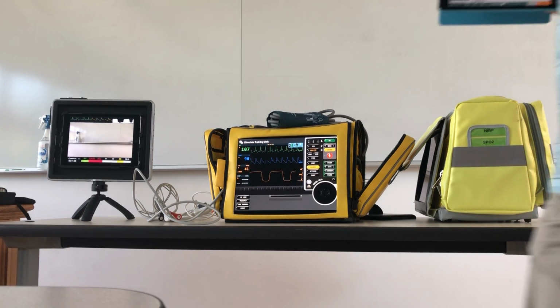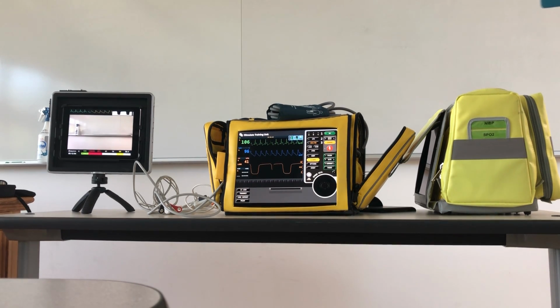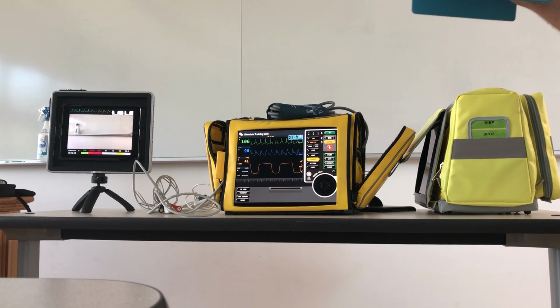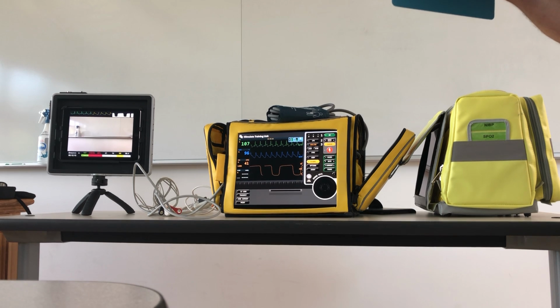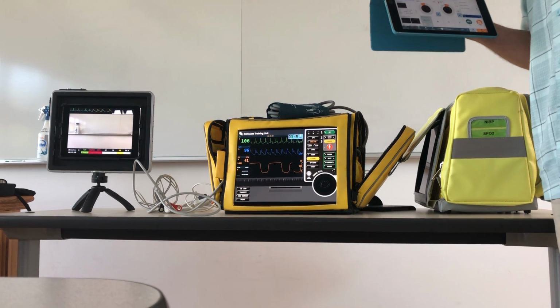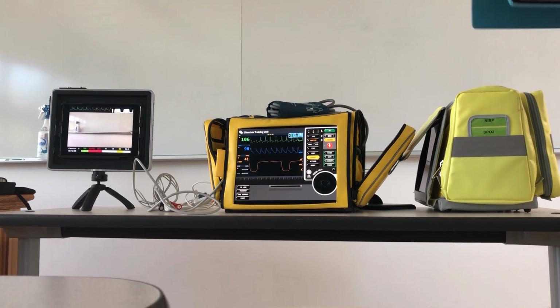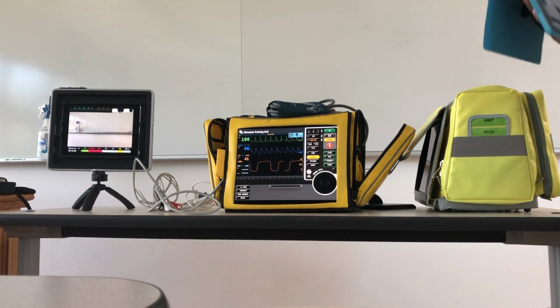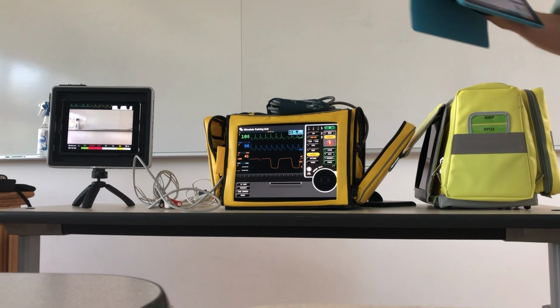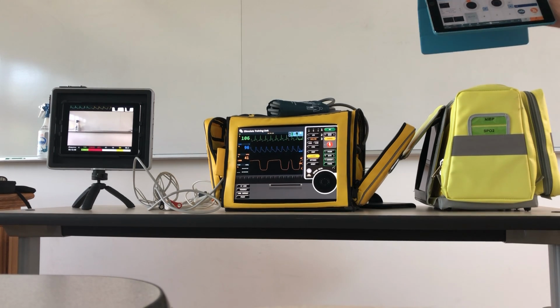And what I started to say is that fourth iPad that you can add in, and you don't have to buy it from them. You can get an iPad. You can add the Reality software to it for free. And then that other option is you can pick Chart. And that becomes sort of a documentation tool. Right now, it's not set up for actual charting, doing your subchart, but I think they're going to build that in eventually. But right now, it's a place you can send a 12 lead, you can send lab values, you can send whatever you built into your scenario to an iPad that one of the team can be holding and looking at separate from the device. So that's the way you tear it off and hand it to them, is you can actually send it to another iPad, but that means adding one more iPad to the mix. Anyway, so that's kind of what you do with that.